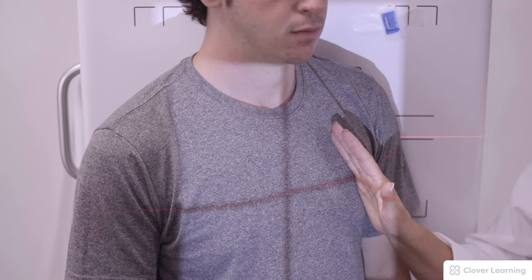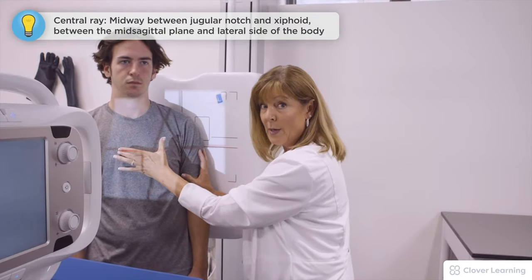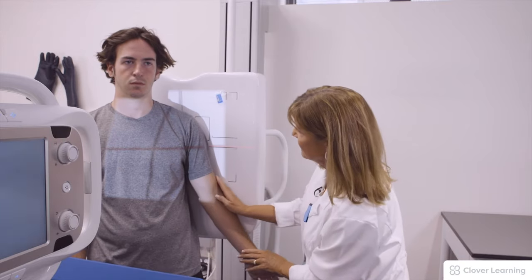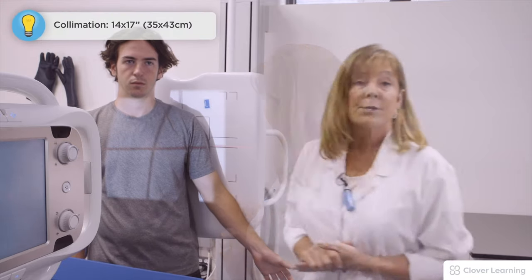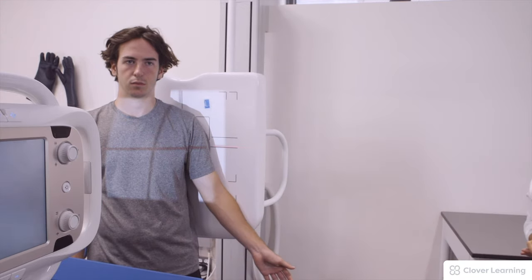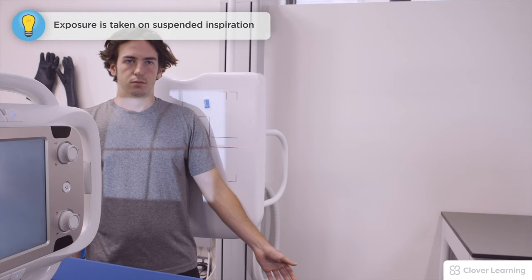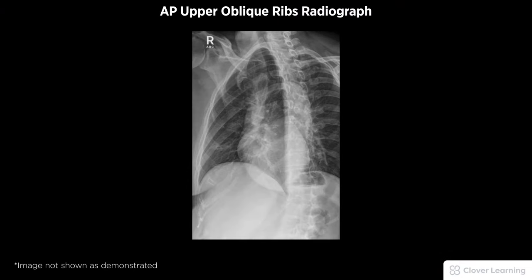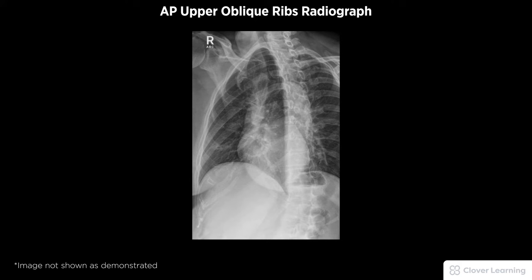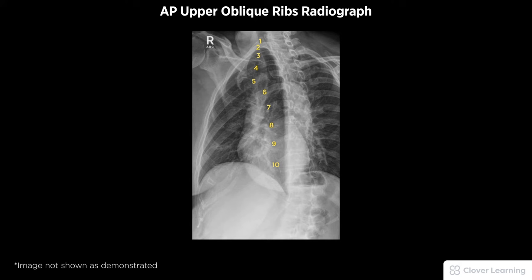The central ray is again halfway between the jugular notch and the xiphoid. Centering to the left part of the chest, we use the mid-sagittal plane to the lateral side of the body and center in between. The patient's arm is extended out, a left marker is placed on the left side, and the patient takes in a deep breath on inspiration and holds. The exposure is made. A diagnostic AP upper oblique rib radiograph should be free of motion, demonstrate proper rotation, and include the first through tenth posterior ribs in their entirety.